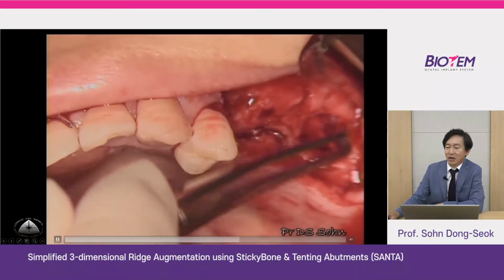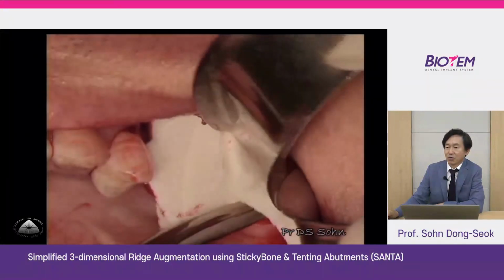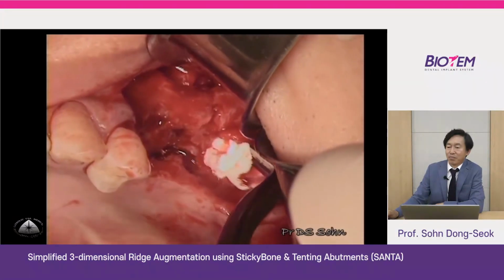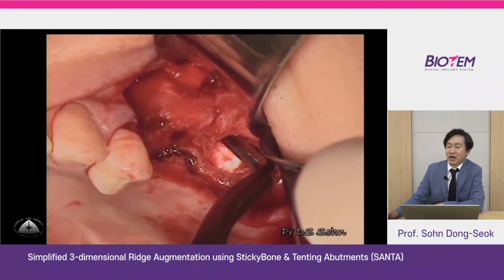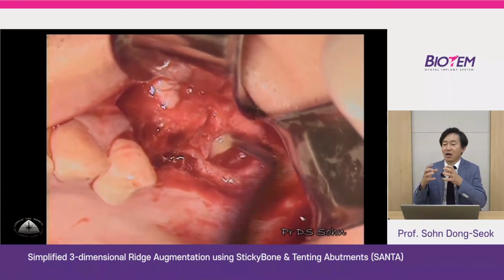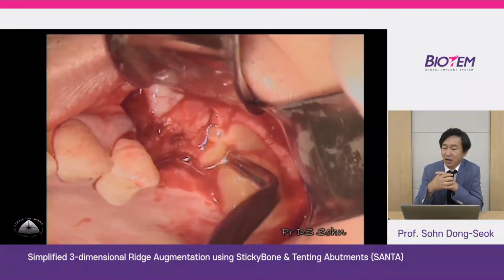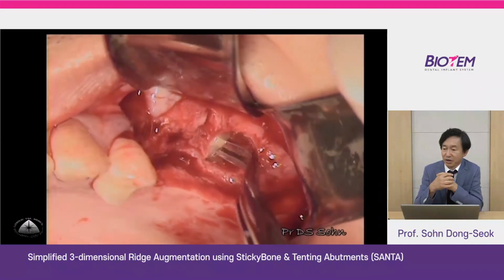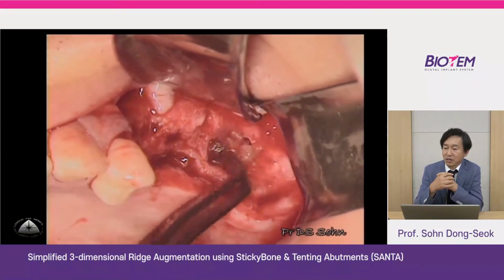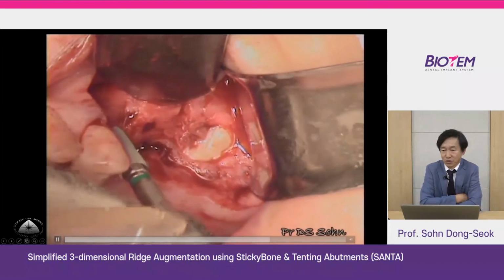After osteotomy at the implant site, the implant should be placed to get stability. To repair the large perforation of the mucosa, a resorbable gelatin sponge was placed. This gelatin sponge holds the blood coagulum under the elevated sinus mucosa, so it accelerates bone regeneration during the healing period. A few pieces of CGF block were also placed to accelerate bone regeneration in the sinus cavity. No bone graft was used because it's risky.